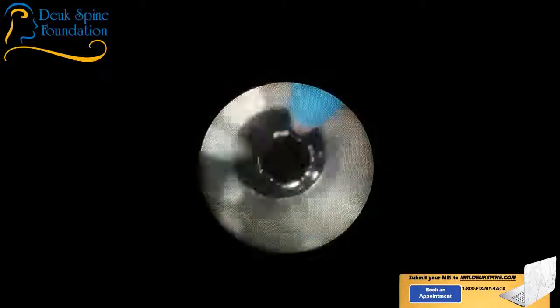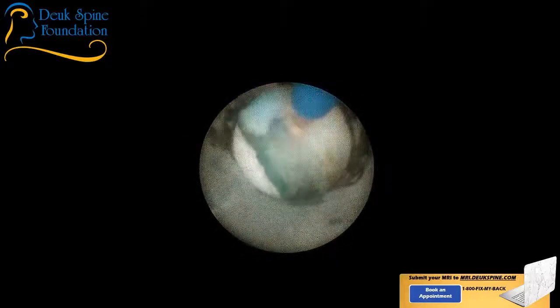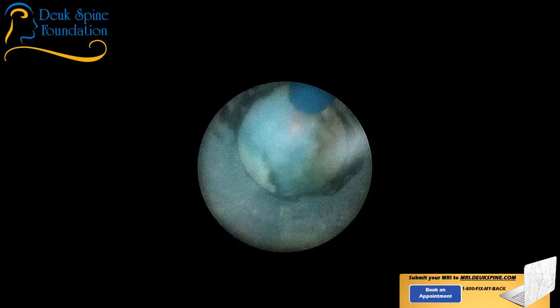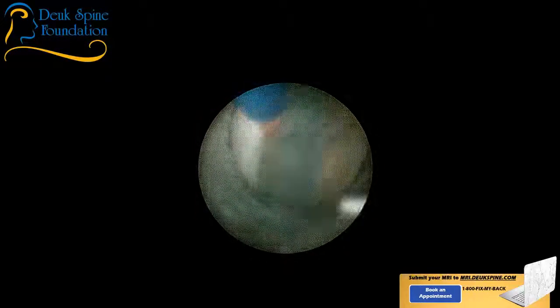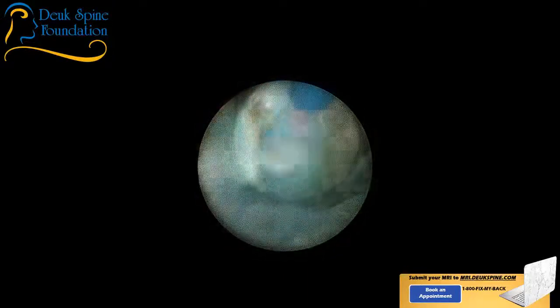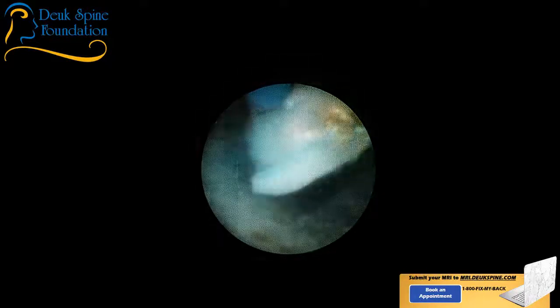There's another piece. By the way, just so you understand, on the left is the end plate, and on the right is the end plate. So I'm working right between the two end plates. The end plates are the bones, the vertebral body bones. I'm working right between them. Like I said, this herniation, I'm actually able to go side to side. There's a big chunk right there. See that? I'm going to try to grab that out.